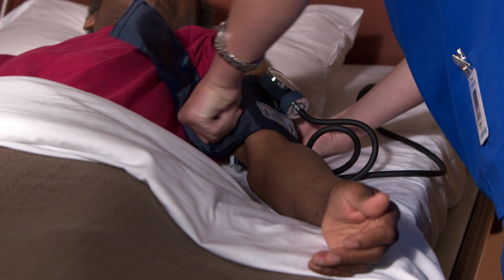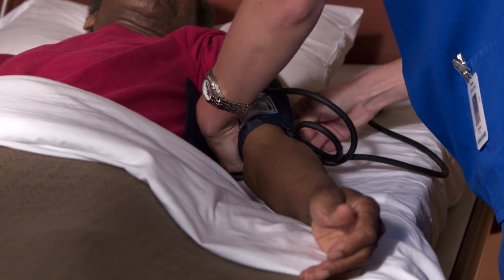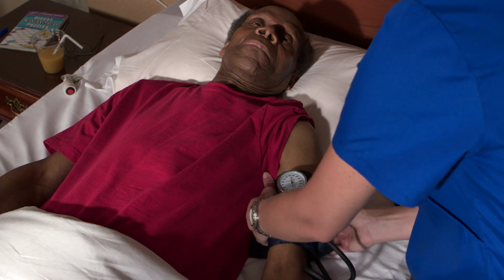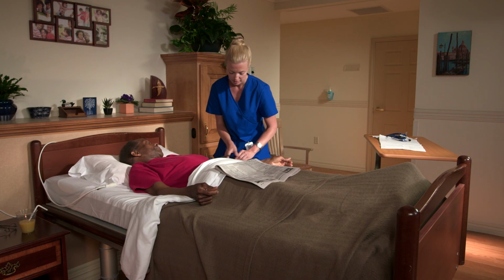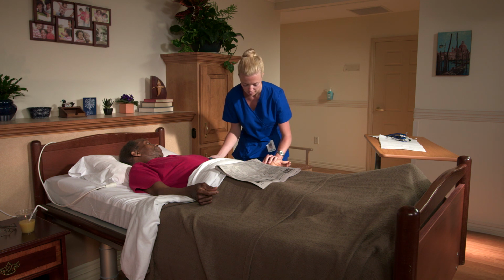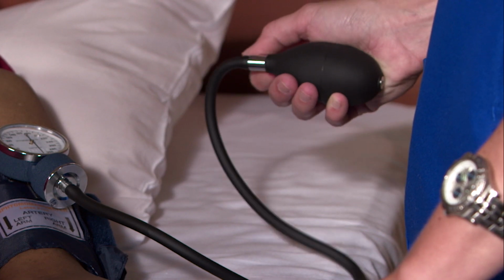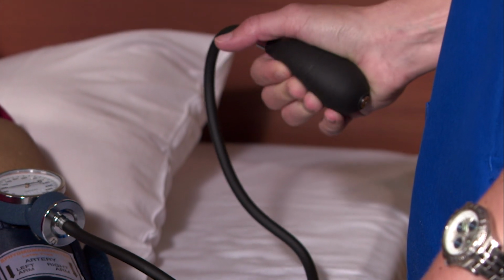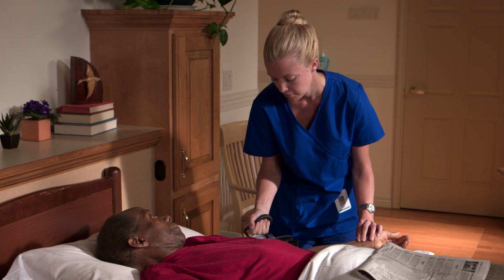Wrap the cuff around the person's arm snugly and smoothly and secure the cuff. Make sure it is snug enough to stay in place, but not uncomfortably tight. Perfect. Place your fingers on the person's radial pulse on the wrist. Turn the screw to the right so that the cuff inflates when you pump the bulb. Inflate the cuff by pumping the bulb until you can no longer feel the radial pulse.